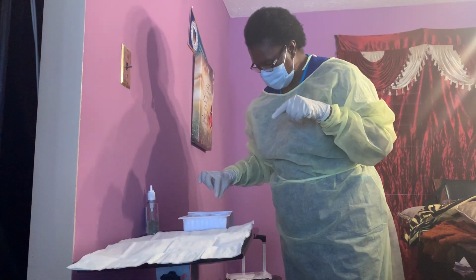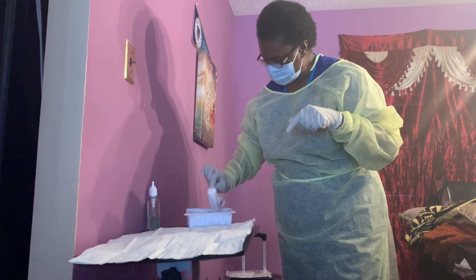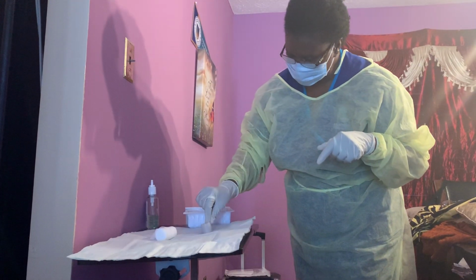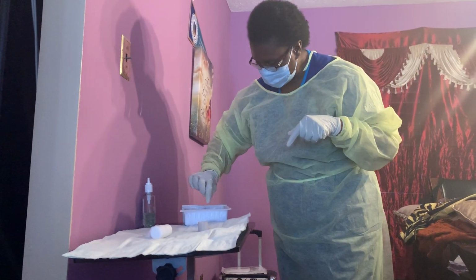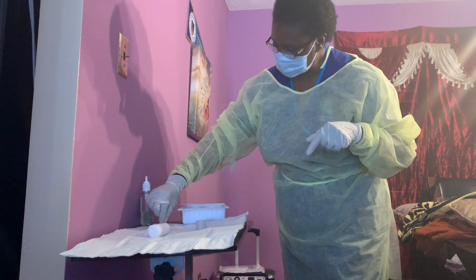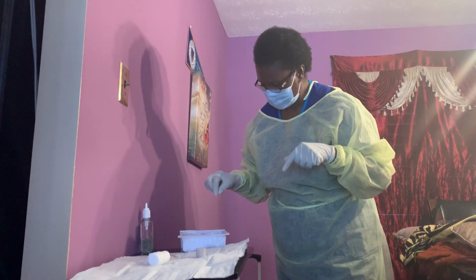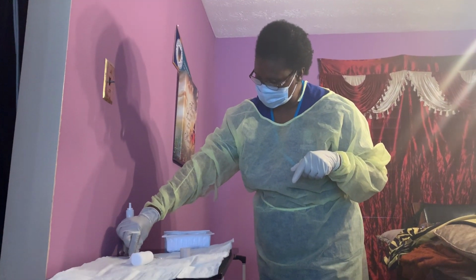So I'm gonna take everything one by one. This is my sterile hand, put my clean wrap, my tape, gonna pick my Q-tip, and then I'm gonna put it in here. Most of it is inside the sterile field. So, and then I'm gonna do the same thing for the scissors. The tip is inside the sterile field.